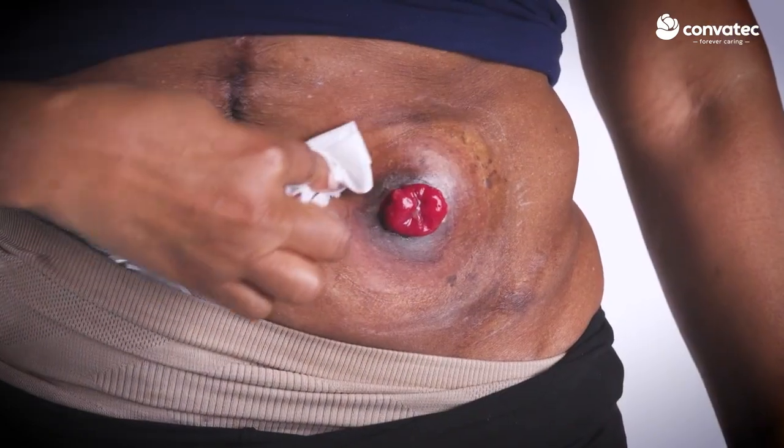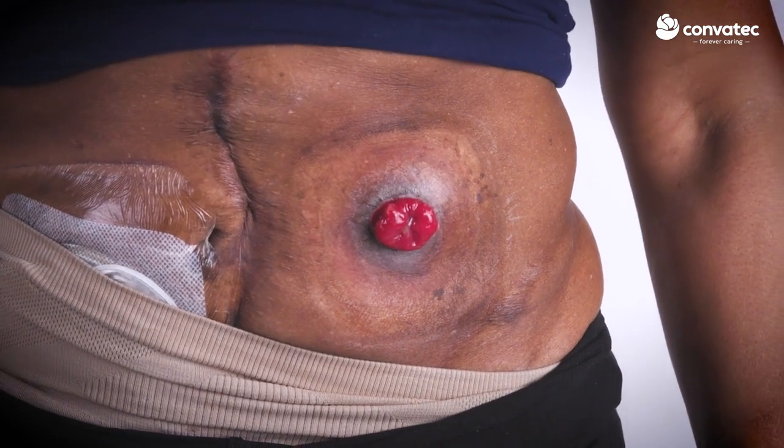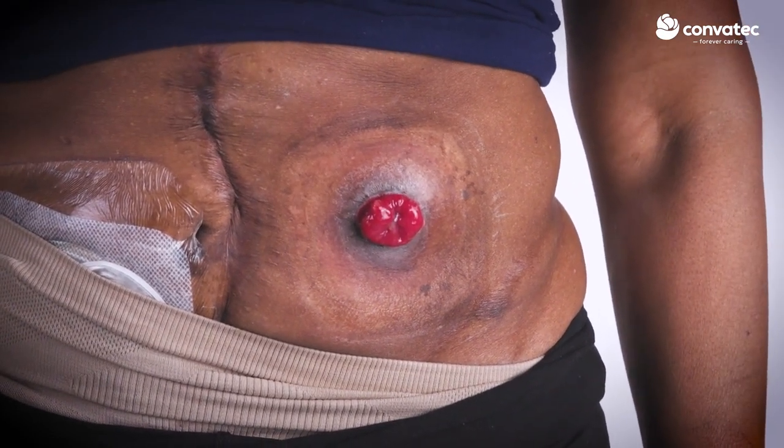Next, apply the skin barrier wipe or spray to the skin around your stoma and let it dry. Now you are ready to apply your new base plate and pouch.